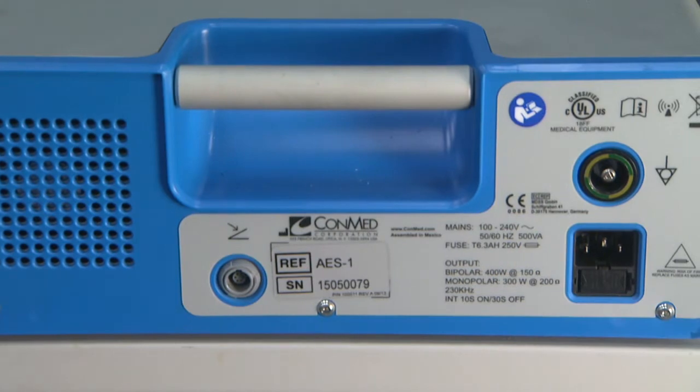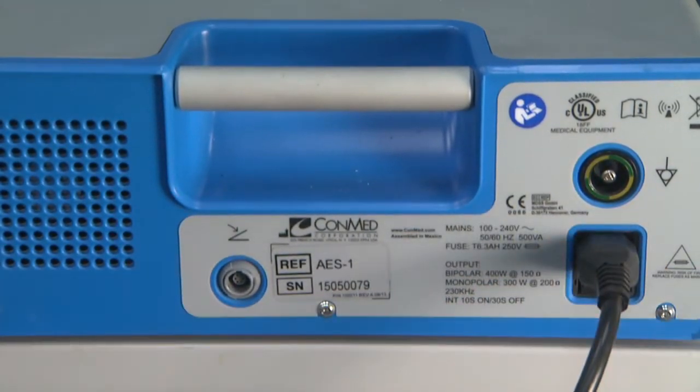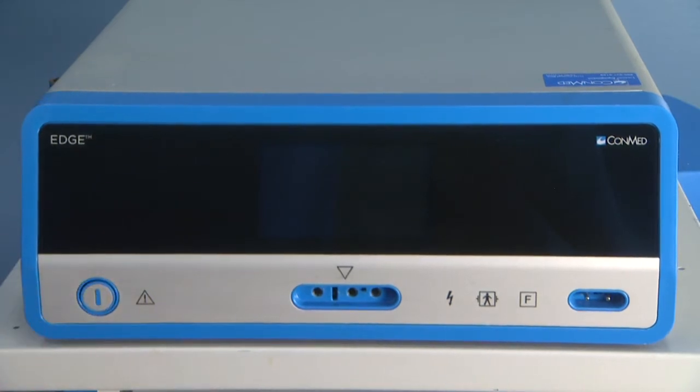To begin setup, plug the power cord into the back of the generator and into a power outlet. Press the power button to start up the system.